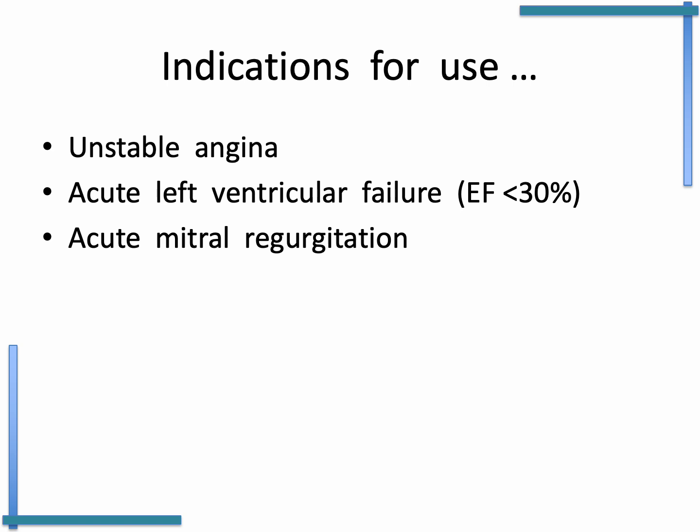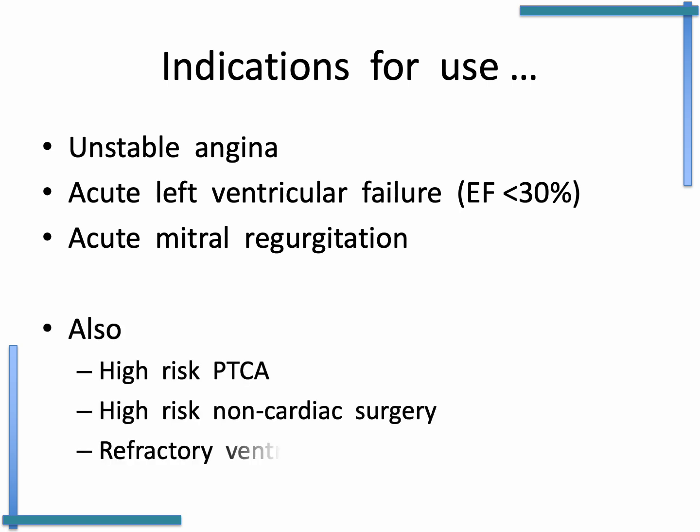Also, acute left ventricular failure is an indication, and acute mitral regurgitation is generally accepted as an indication for its use. Also, high-risk percutaneous coronary intervention, high-risk non-cardiac surgery, although this is more contentious, and in refractory ventricular arrhythmias it may also be considered, but probably even more contentious.